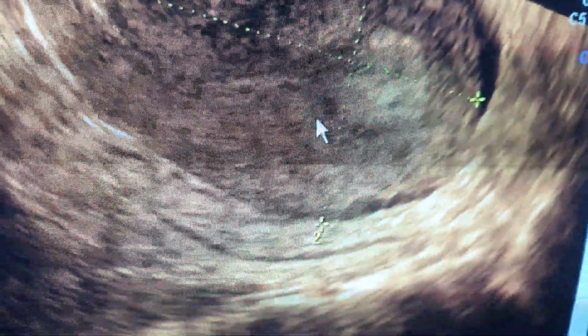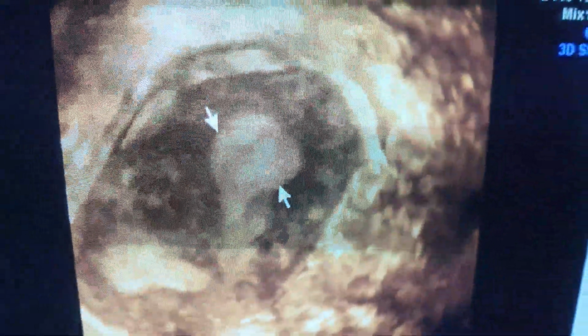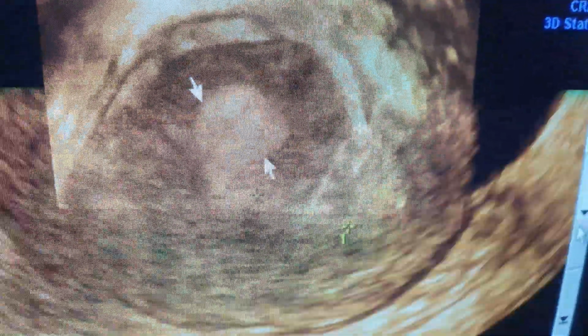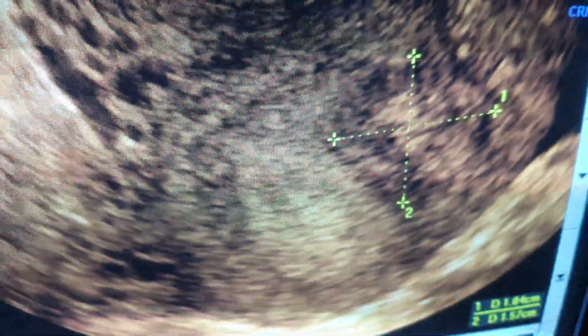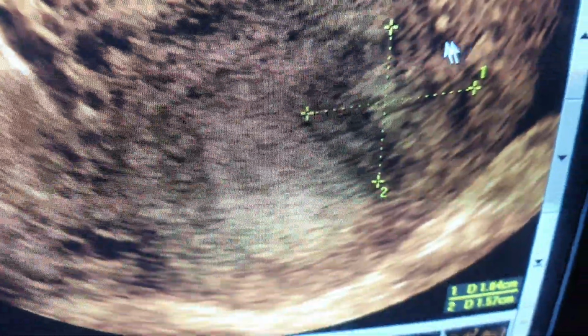Of course, there's something here, as you can see. And of course, you can suspect a polyp. Okay, and then after doing 3D ultrasound, when you want to see the picture by 3D ultrasound, you'll notice again this. But before I get to the 3D ultrasound picture, I want to show you another plane here in which there is something appearing.